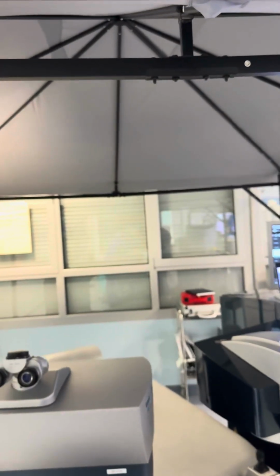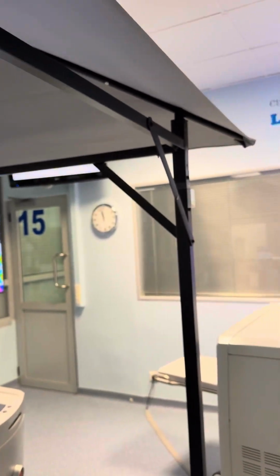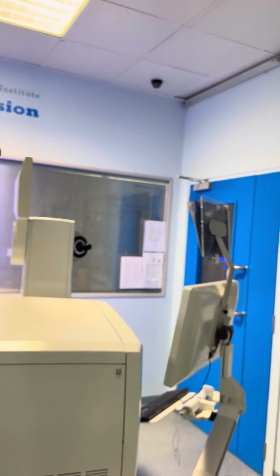Hello, it's John Kanellopoulos in our center here in Athens, Greece, the Laser Vision Ambulatory Surgery Center. We're in our laser suite. We have the Alcon refractive suite, the FS200 femtosecond laser, and the WaveLight EX500 excimer laser, and the Zeiss VisuMax 800.